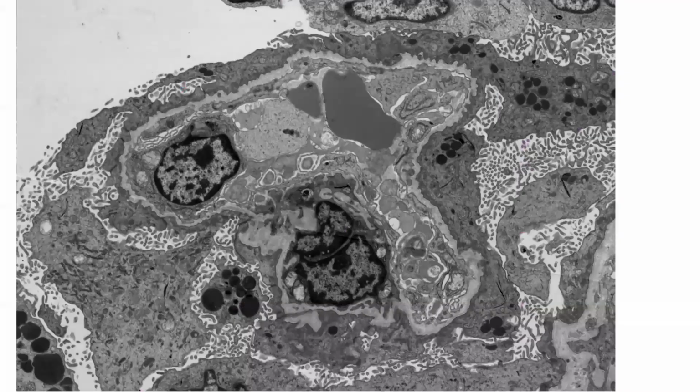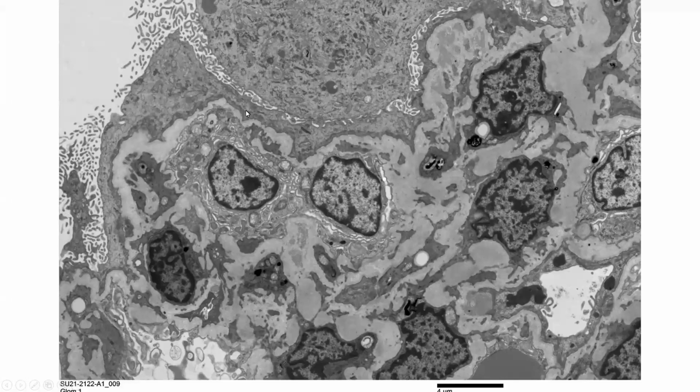The other striking thing was the progression of the electron microscopic findings compared to 2014. Remember, in 2014 what we mostly saw was thin glomerular basement membranes. Every so often, if you hunted around, you could find areas where there was irregularity and lamellation. By contrast, in 2021, in the same kidney, there is diffuse effacement of foot processes with extensive microvillus transformation. You can see that now the basement membranes are very irregular in their thickness and composition. Looking more closely, you can see areas of dramatic thinning right next to areas of dramatic widening and rarefaction.